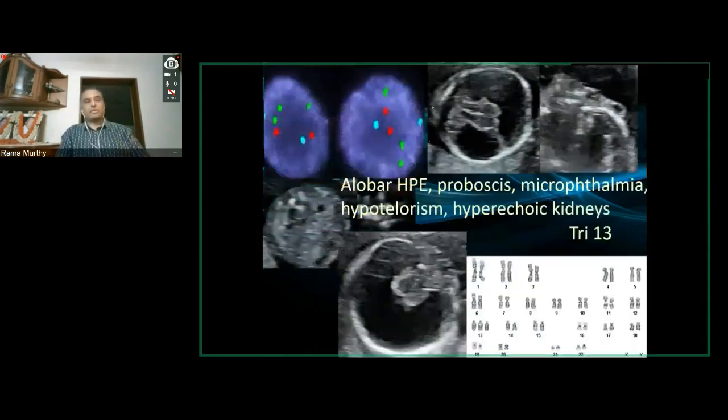So here's another case. We will move back to another case, and this is, of course, the same heart-shaped, uncleaved thalamus, a huge ventricle which is draping over this thalamus out here. This is a sagittal section of the face showing you a proboscis. Instead of the finger-like projection, proboscis sticking out as we saw in the previous, this one is pointing upwards and is actually flush against the forehead like this.